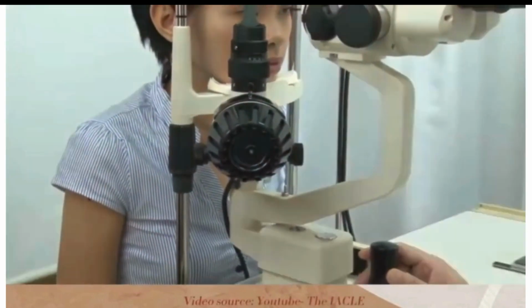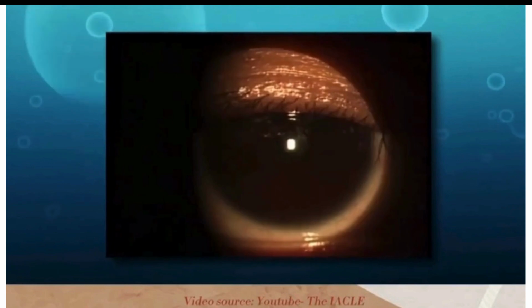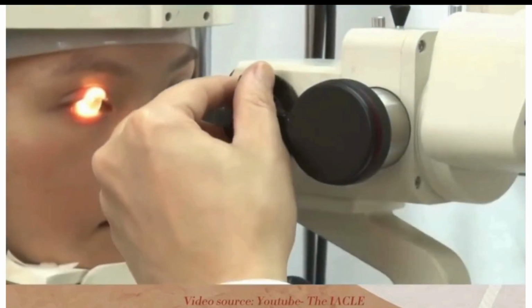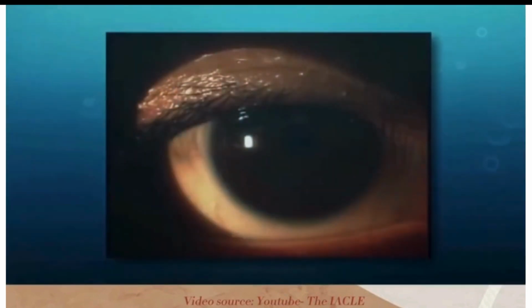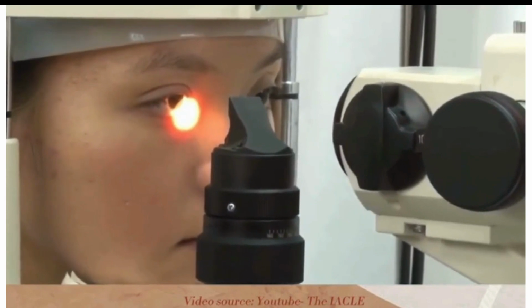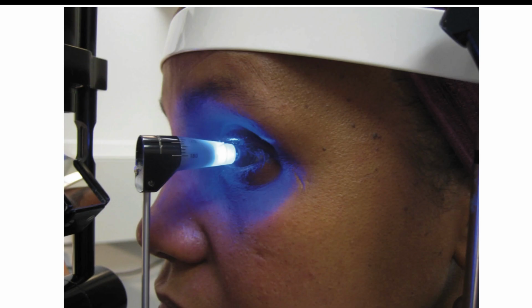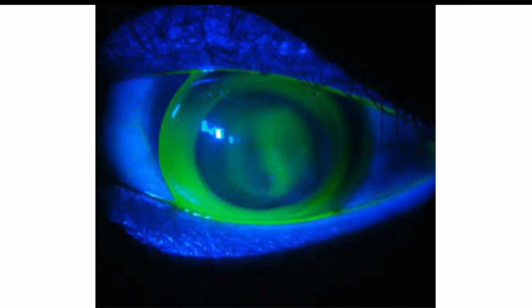The slit lamp is indispensable for the detailed examination of virtually all tissues of the eye. It is routinely used for the examination of the anterior segment, which includes the anterior vitreous and the structures that are anterior to it. In addition to physical examination, it is also used in tonometry, linear measurements of tissues and lesions, and ophthalmic photography. It can also be used in contact lens fitting.